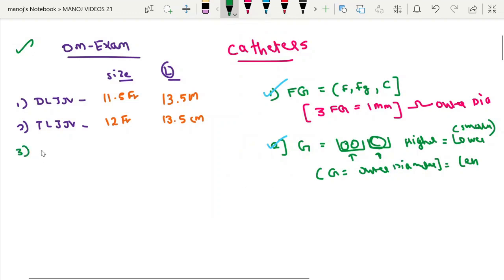Third is the straight catheter which we commonly call as double lumen femoral catheter. The size is 12 French and the length is 16 cm. For the single lumen dialysis catheter, which commonly we call as single lumen femoral catheter, here the size is being mentioned as 14 gauge and the length is 13.5 cm.